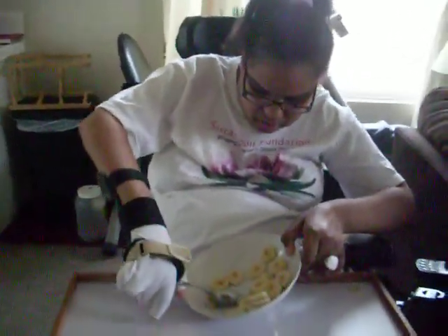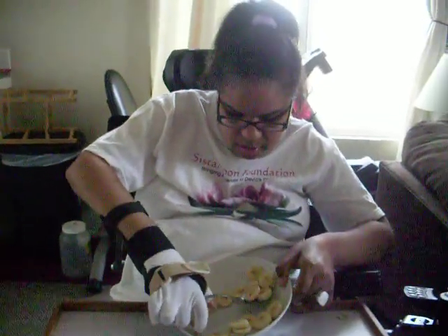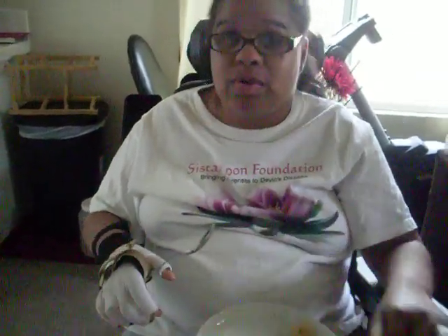This is Dawn trying to use her spoon to get her food in her mouth. And what is that apparatus called, Dawn, on your hand? It helps you hold your spoon. It's like a brace that has a splint that you can put your spoon or fork in.